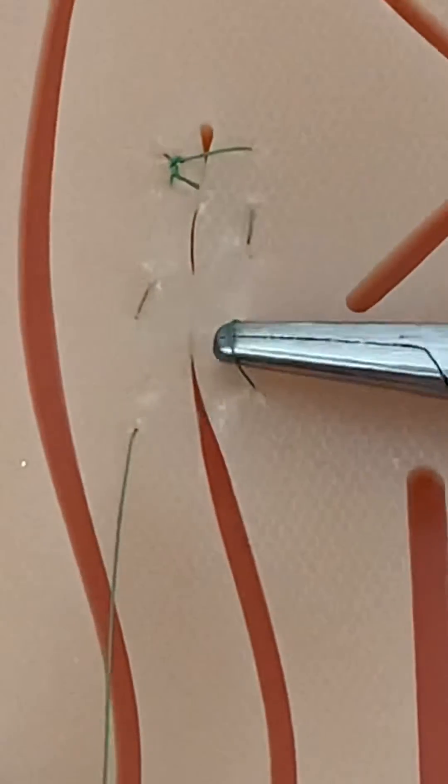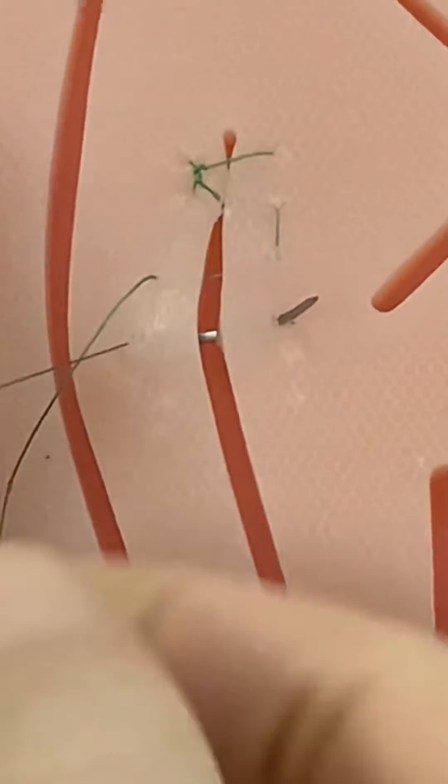If you make a mistake when suturing, sometimes you can pull the needle back through the flesh to fix it, but this may lead to the suture snapping.